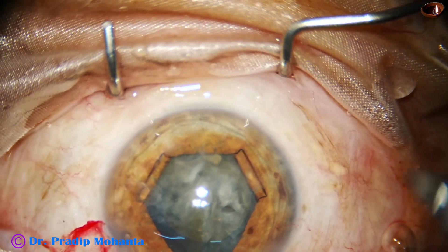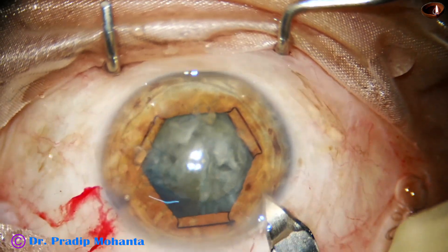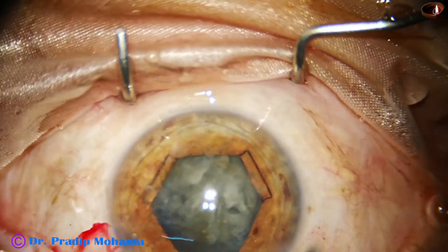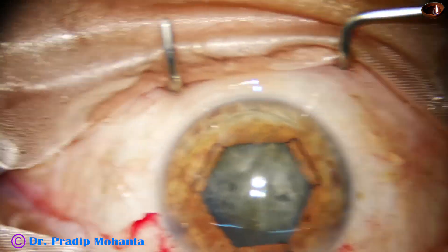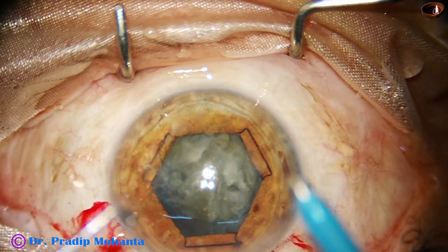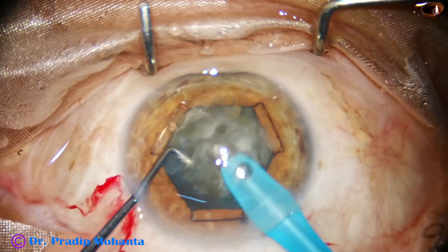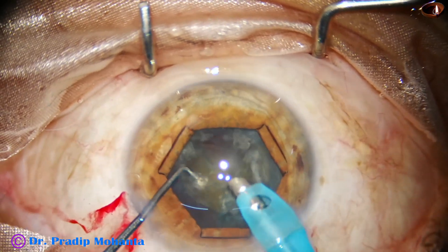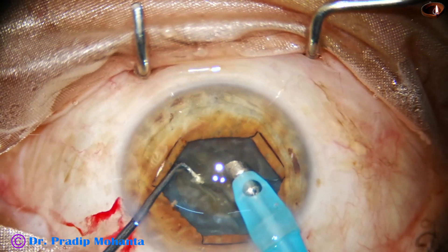And now is the time to go in with the handpiece. Enlarge the main incision to about 3 millimeters, and then the handpiece is introduced. The handpiece goes beveled down. The B-hex pupil expansion device keeps the iris at its own plane, so just go and start emulsifying the pieces.